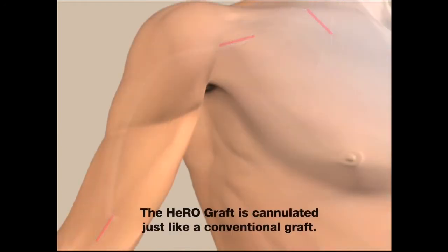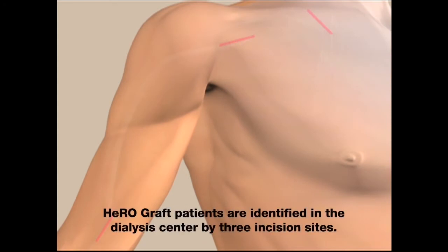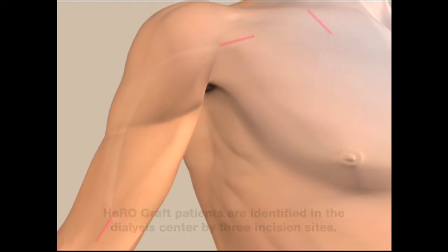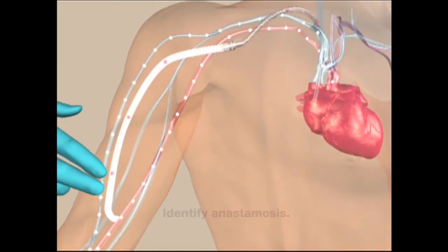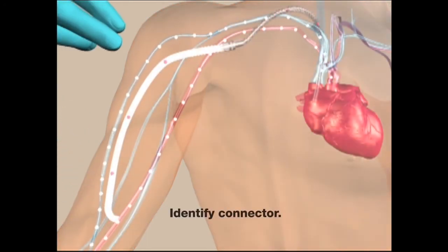The HeroGraft is cannulated just like a conventional graft. HeroGraft patients are identified in the dialysis center by three incision sites. Identify the anastomosis and identify the connector.